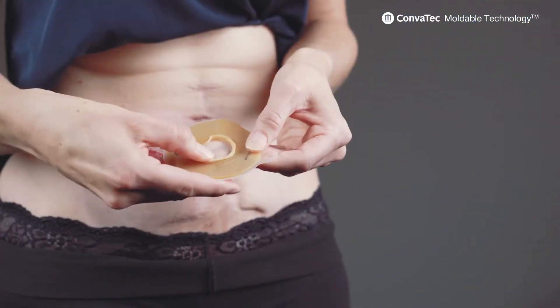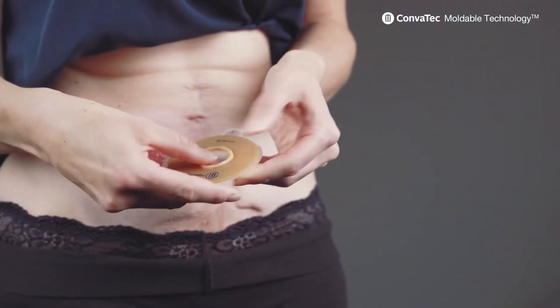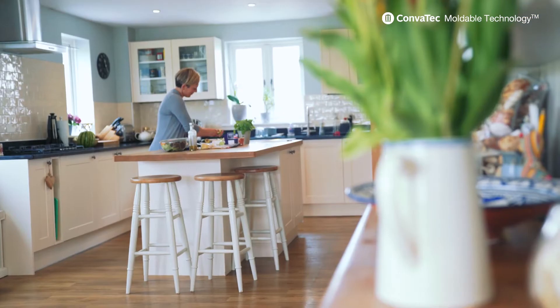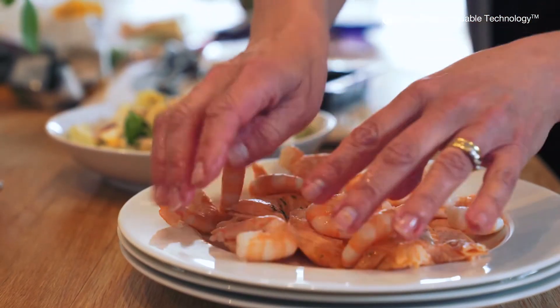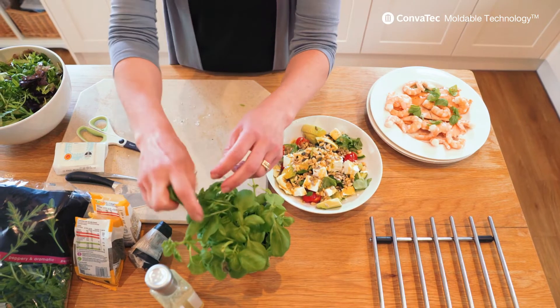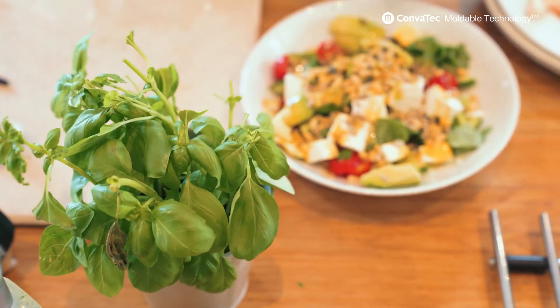Convatec Mouldable is so simple to use. You don't have to cut it — you mould the edges and then it springs back to the exact size of your stoma. It becomes so fast, I do it in a few seconds. It's quite common for my stoma to change in size throughout the day and from day to day, which is normal. You need a really robust product to deal with that kind of situation.